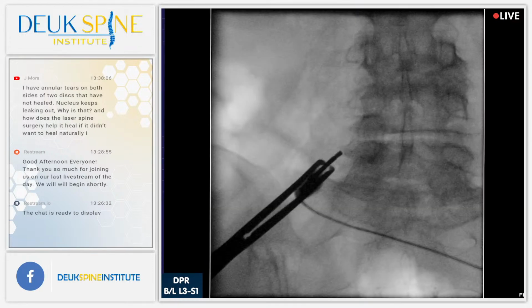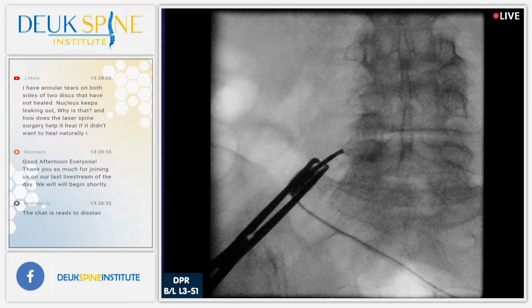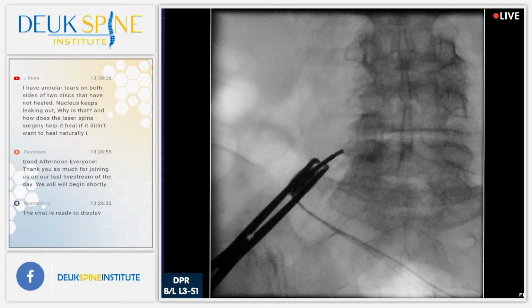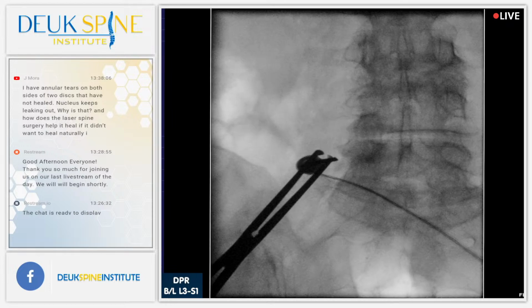And welcome back. We're currently working on our third medial branch of the dorsal ramus at L5. Our last one will be at S1. I'm using the X-ray to verify that my burn positions are perfect, as good as we can get at least. Maybe not perfect, but as good as humanly possible. I'm okay with as good as humanly possible. I'm not good with anything less than that, though.